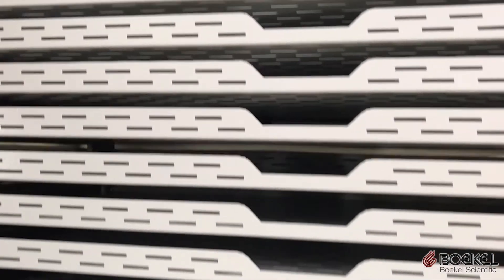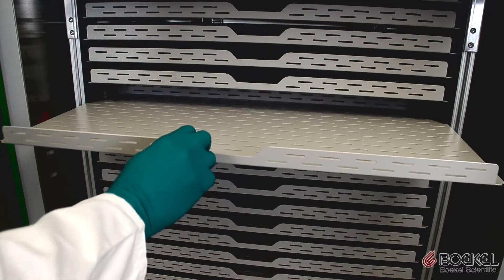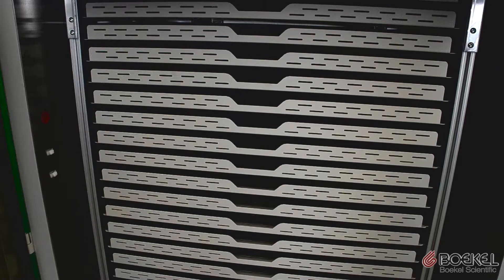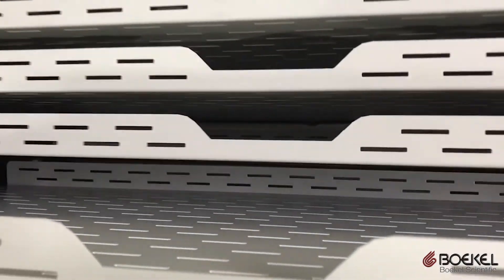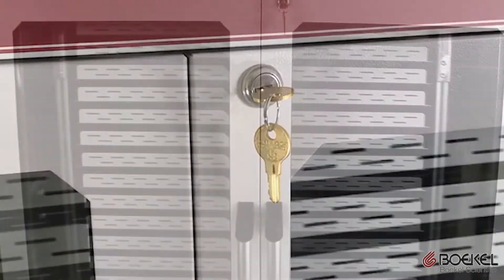The Bocal Scientific FS100 can store up to 100 units of platelets on 25 removable shelves. Each shelf slides easily in and out and is removable for cleaning or for creating extra space. The unit also has lockable doors to secure quarantined material.